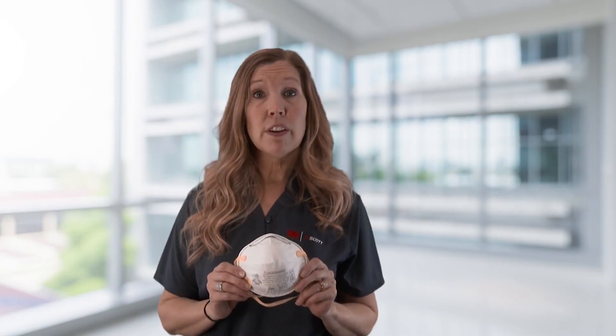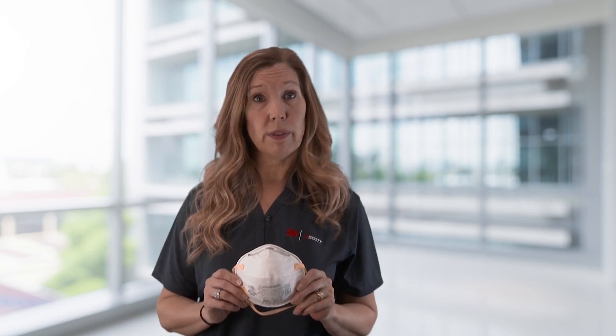Filtering facepiece respirators such as N95, FFP2, and KN95 respirators can help reduce wearer's exposures to dusts, mists, and particles. Here are a few tips on proper use. It is very important that you put the respirator on properly, following the user instructions.